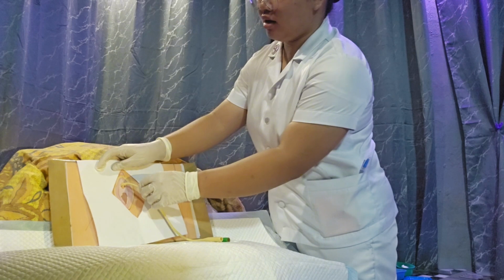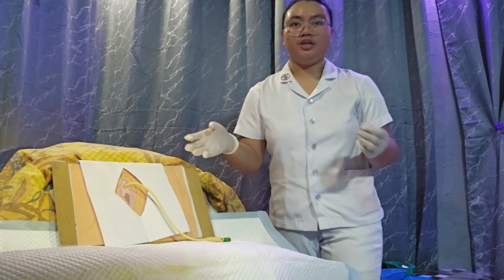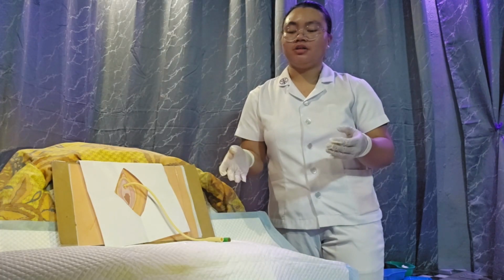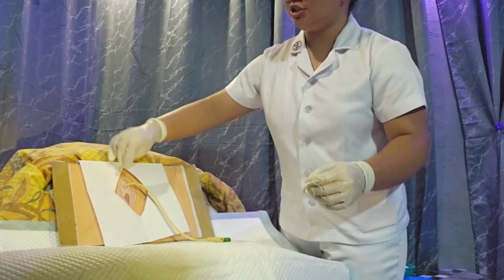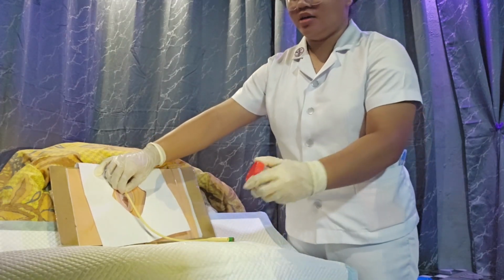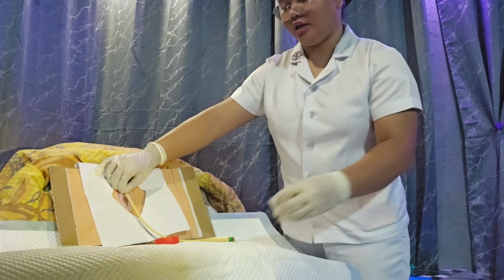So after ensuring that we place the catheter properly, we are now going to check. So since the physician requires a urine sample, we are going to pinch the catheter in place and then get the specimen container and place it properly into the specimen collection.